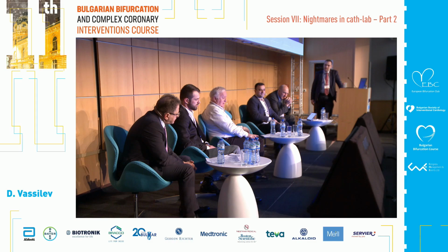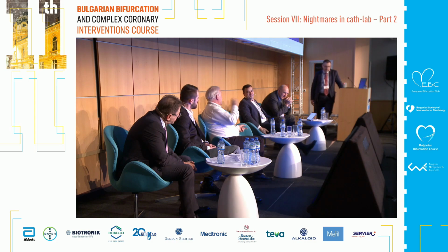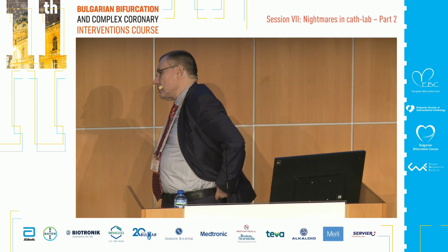Actually, this is in non-CTO cases. So this is my third case. This is creative, but you don't have to lose your wire. Yes. We have 3 cases already. This is the only one with rotablation.